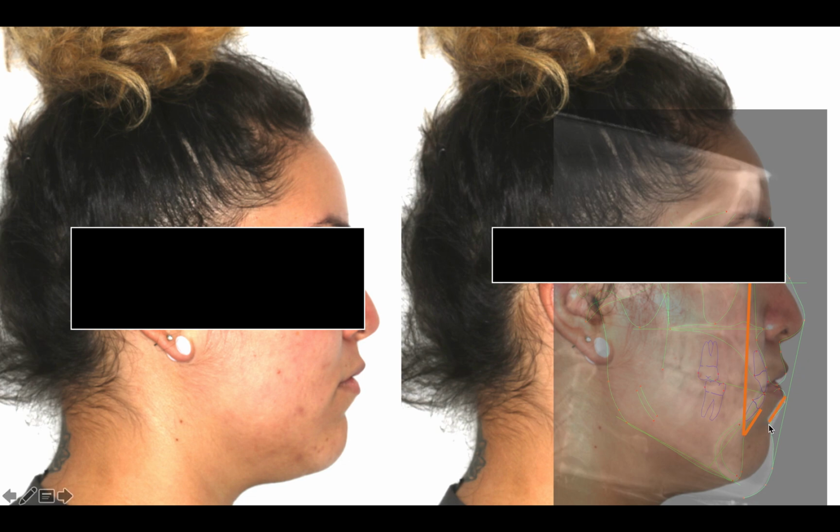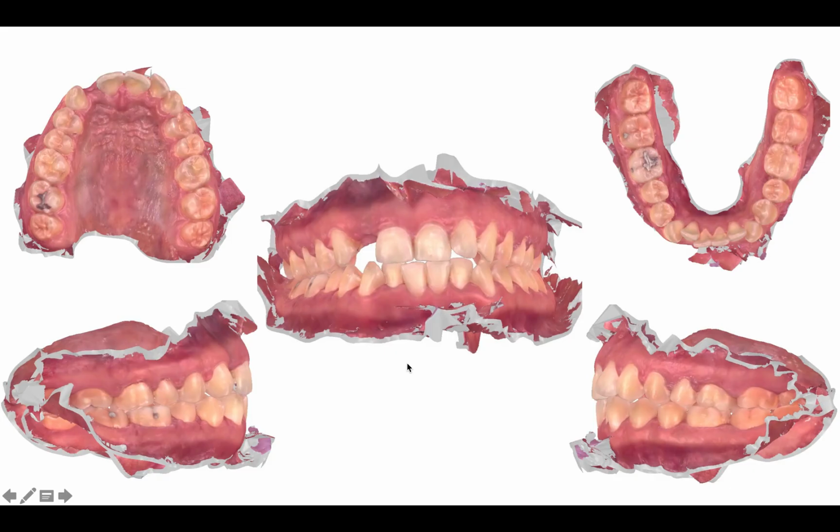So here again, just mirroring that line, we can see that we have that same angulation brought out, which is a parallel line here, and we know that we want to be a little bit more upright and have more of a competent lip closure. So here, this is, again, compliments to Dr. Mana Naeem in the Graduate Ortho Clinic using their scanners.